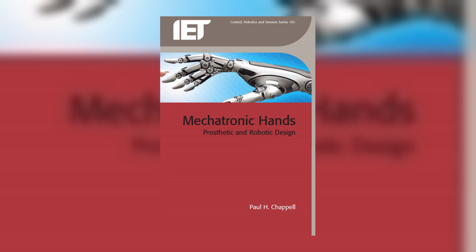This section explains what a finger is, structurally, inside a hand you design. A finger is a transmission. Its whole meaning is the map from one motor's torque to fingertip force, and that map is what you design. Chapter 1. Cut the hand into 3 terms: actuator, mechanism, and sensor. This chapter takes the middle term, the mechanism, and shows that its design space collapses to a single lever.